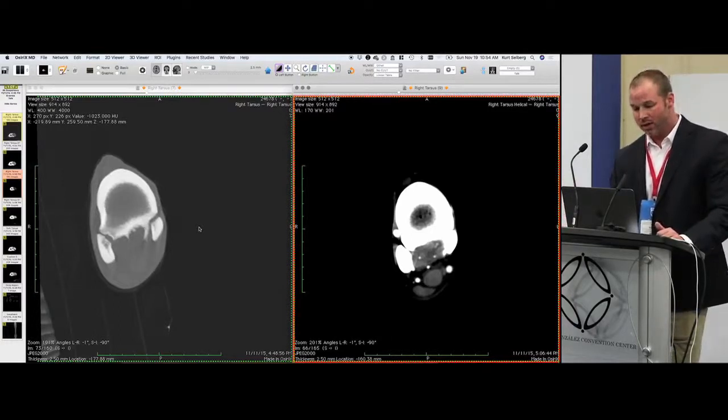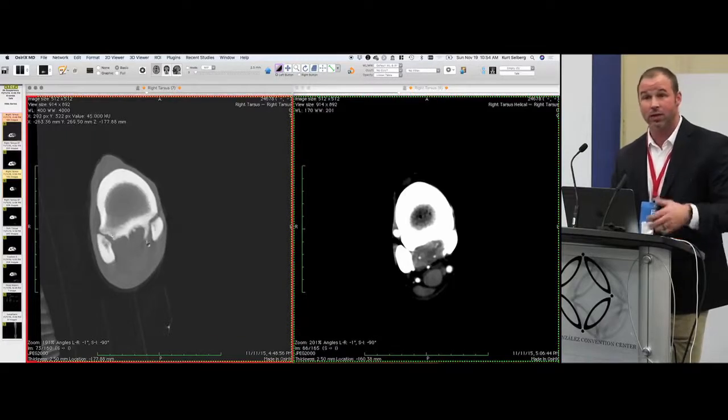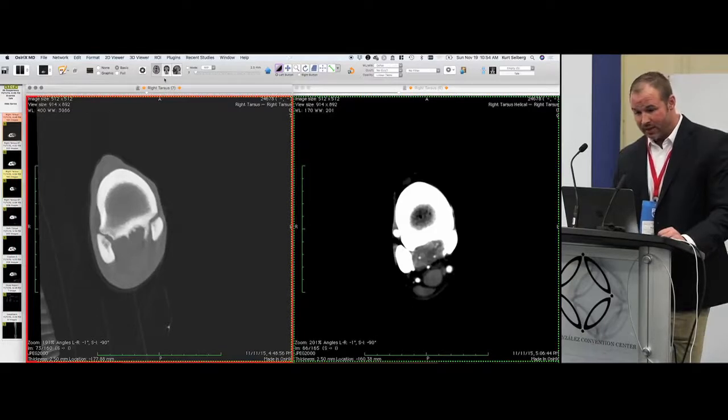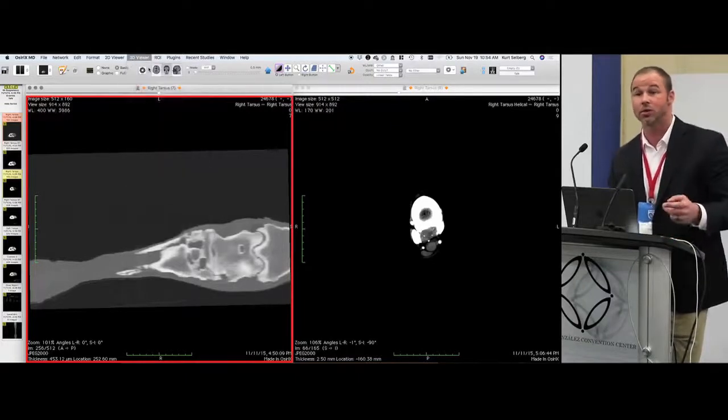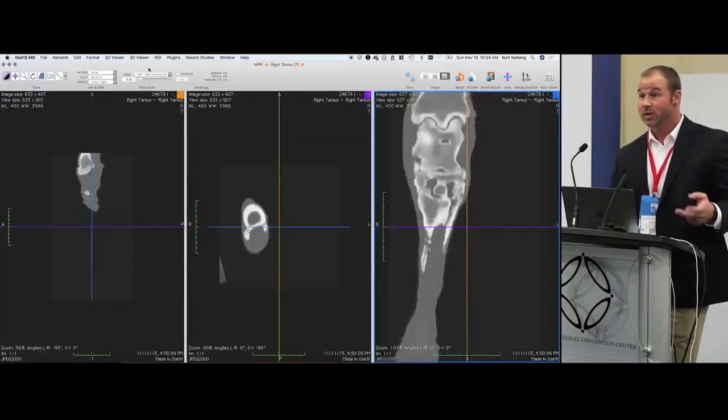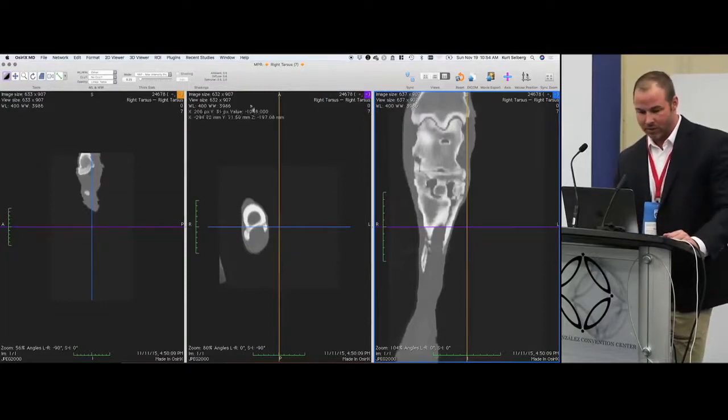And the other area, and we went over this yesterday a little bit in some of the table topic, is the tarsus and proximal aspect of the suspensory ligament, which are a challenging area because there's oftentimes overlapping areas of pathologic change. They oftentimes will occur in unison, where you have disease in the tarsus, but also disease in the proximal aspect of the suspensory ligament.